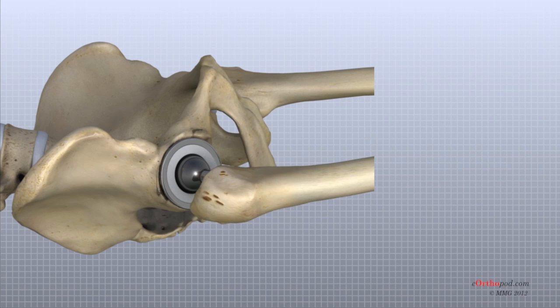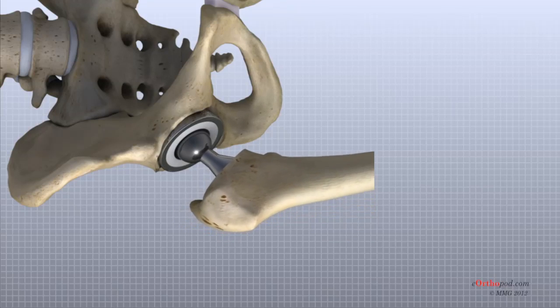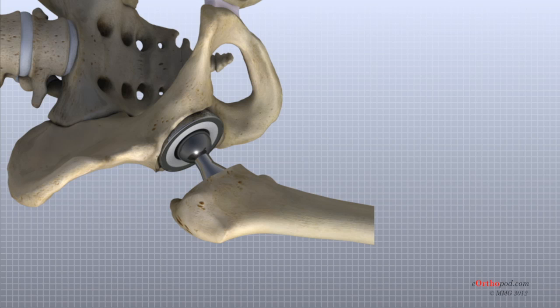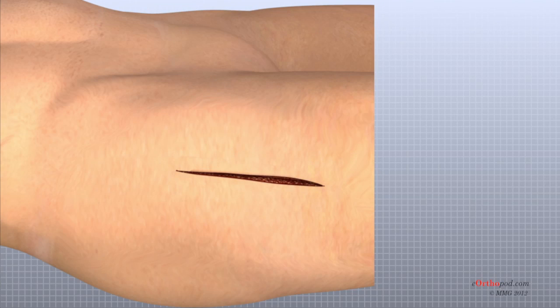The hip is relocated and tested for range of motion and stability. The surgeon literally moves the leg in a full range of motion while watching the ball move in the plastic socket. The purpose of this step is to make sure that the hip moves well through the normal range of motion and does not tend to dislocate. Once the surgeon is satisfied that everything fits properly and is stable, the incision is closed with stitches. Several layers of stitches are used under the skin, and either stitches or metal staples are then used to close the skin. A bandage is applied to the incision and you are returned to the recovery room.